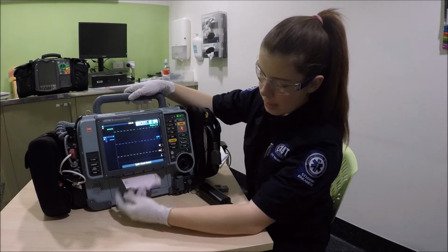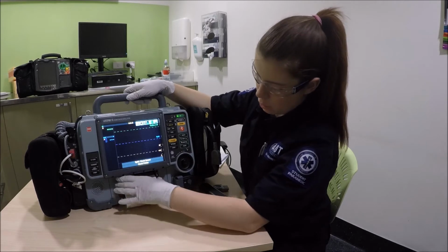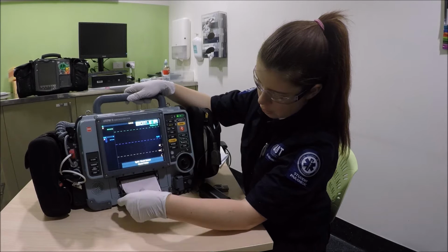Printed off now and it's passed. We'll open it up and check the piece of paper, which there's plenty. If we had to change it, we can just pull it out and put it back in, ready to go.